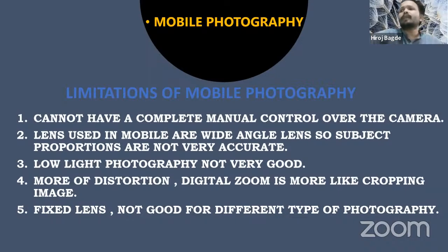But when we talk about macros, when we are dealing with mobiles, we have different macro lenses. I will talk about it in the next slides. We are associated with different kinds of lens systems for macro, which are given to clip on to these mobiles. They are called clip-on lenses.